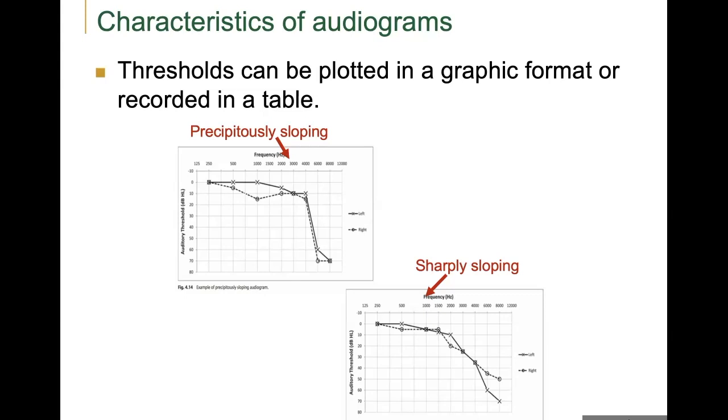But if that person also has a sensory neural hearing loss, when we remove that wax, their sensory neural hearing loss will still persist. So what would happen is this person that has a temporary conductive hearing loss, but a permanent sensory neural hearing loss, will show up as having a mixed hearing loss on your audiogram.